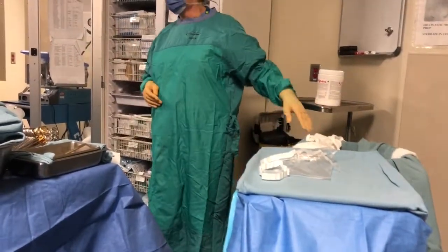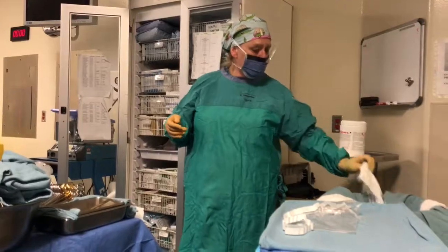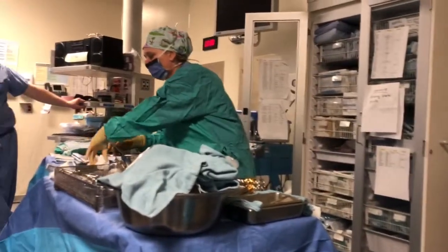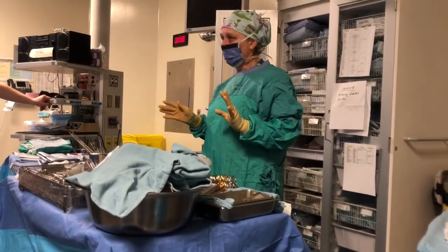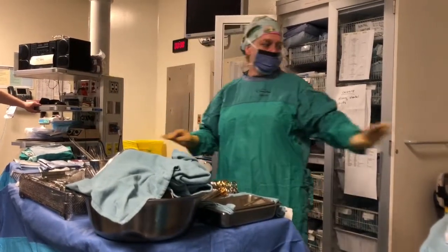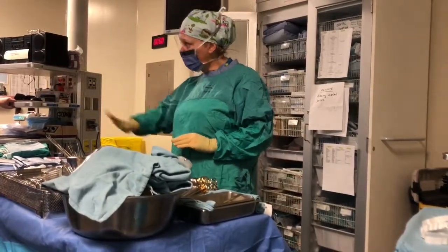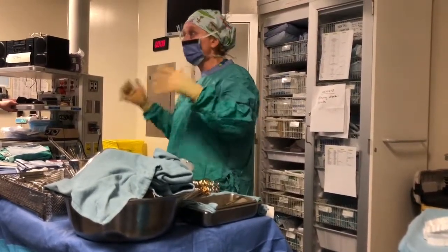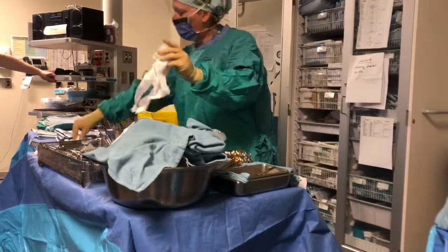So the circulator would make sure that she goes into that bucket and she pulls out with her gloves. She pulls out these and drapes them along so that we see them. So when we're counting from 3 different spots, it's very easy to make a mistake. So what you've got to do is a flow, either from the patient to your table to here, or from here to the table to the patient, and you continue. I'll show you the reason why. I know I've gone over this, but it's been a while. And you guys are going to start counting once you get into your placement. So you're going to go 1, 2, 3, 4, and 5.